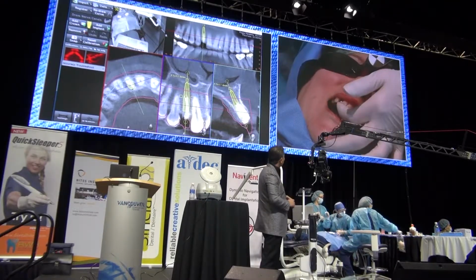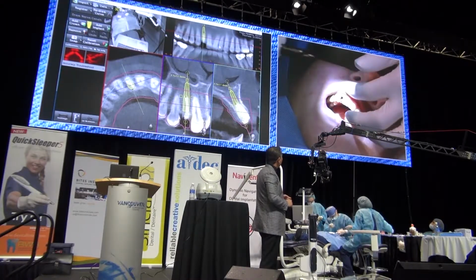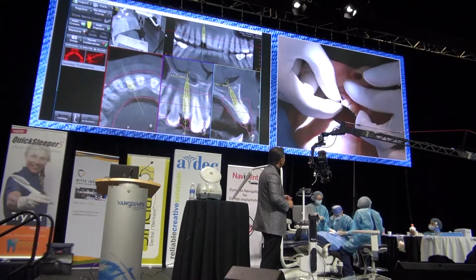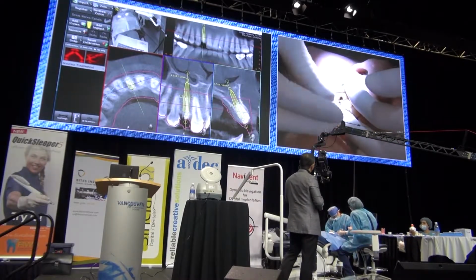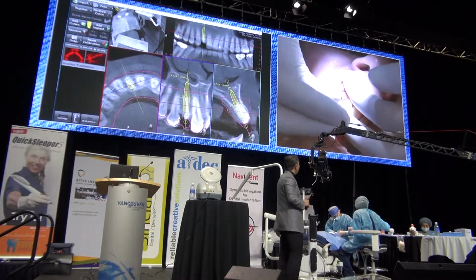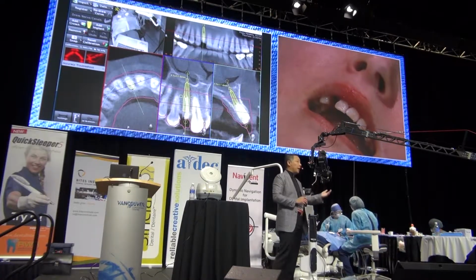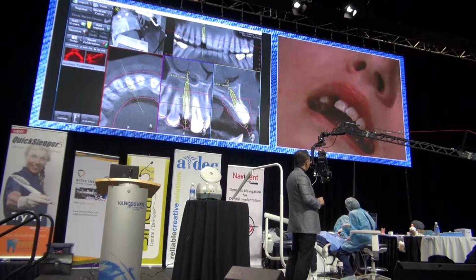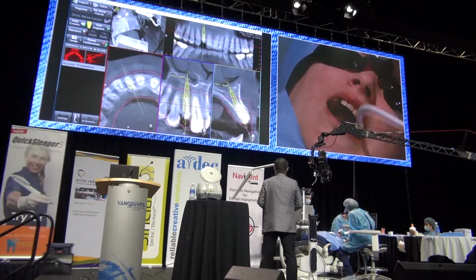Now, once we size, this is a bit of a tricky part: you need to know how much to cut and section the temporary PEEK abutment. Then it's ready for intraoral pickup. Once we do the intraoral pickup, the lab will modify it, and you will be able to see that we need to develop the emergence profile of this particular case.